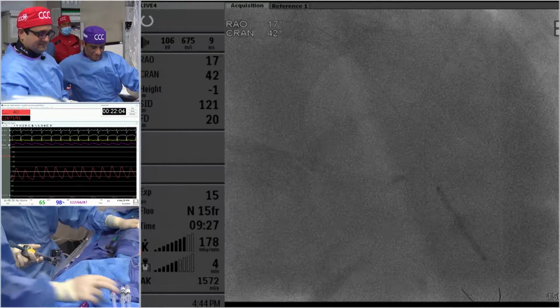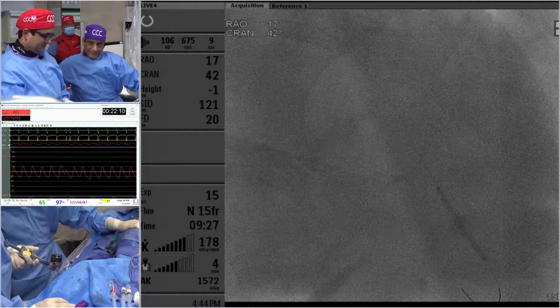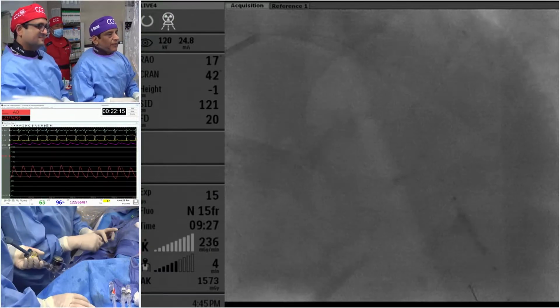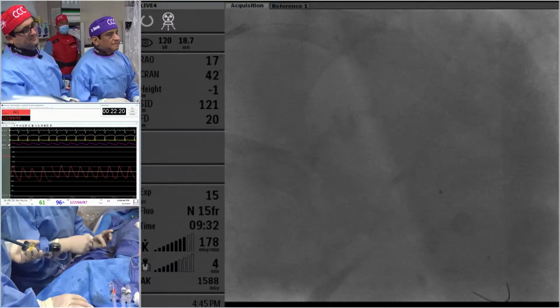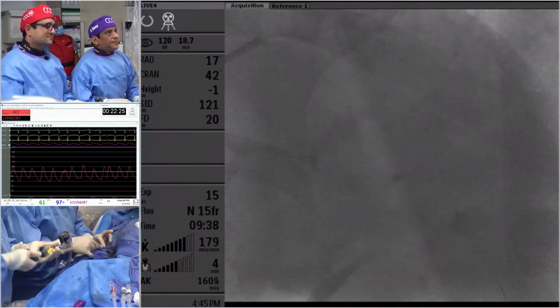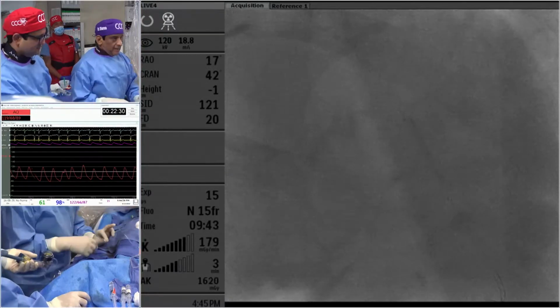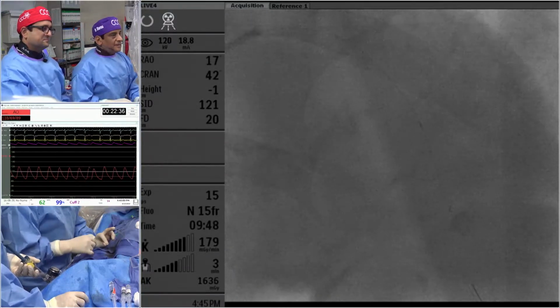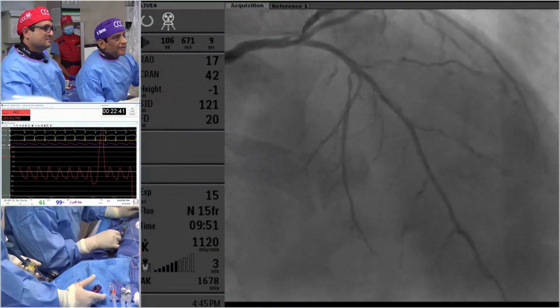The second comment is only because we've been watching either rotational or orbital since morning. Almost 2 decades ago, a case like this used to be a 5-minute single pass with the laser catheter, because it is mild to moderate calcification, a straight, long segment of diffuse disease. One pass and you were done. Again, that's not fashionable or something we use today, but in a day where we've been having all sorts of rotational ablation, maybe it's good to remember technology works for that too.